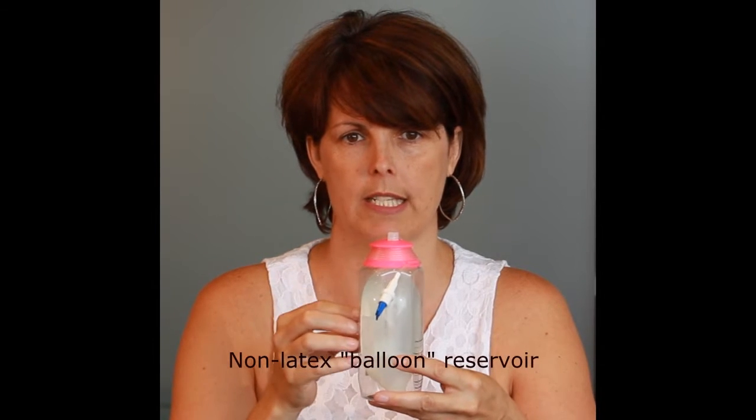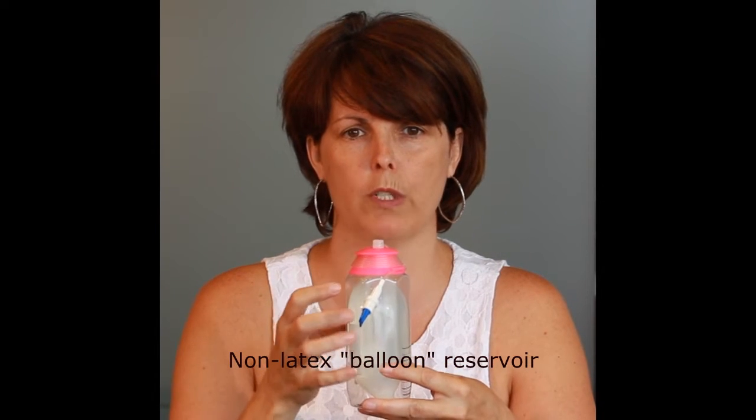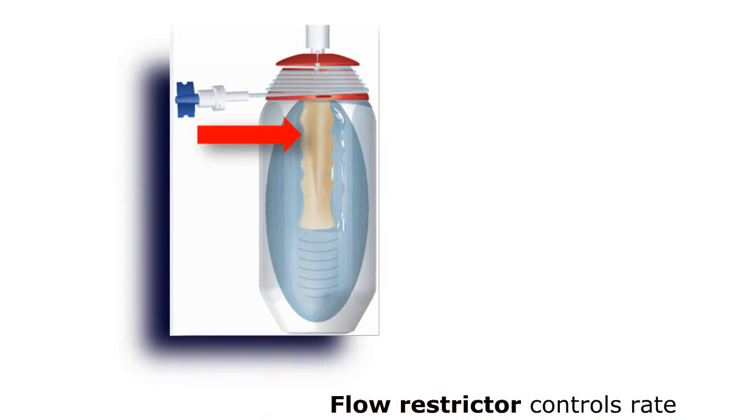This is a Baxter elastomeric infusion pump, which is a portable, single-use, non-electric, disposable pump. There's a plastic case on the outside that houses the elastomeric, non-latex balloon inside, and this balloon holds the fluid. As the balloon deflates, the fluid is pushed up out of the balloon, through a flow restrictor which controls the rate, and out into the tubing. The pumps are available in a number of different volumes and flow rates.